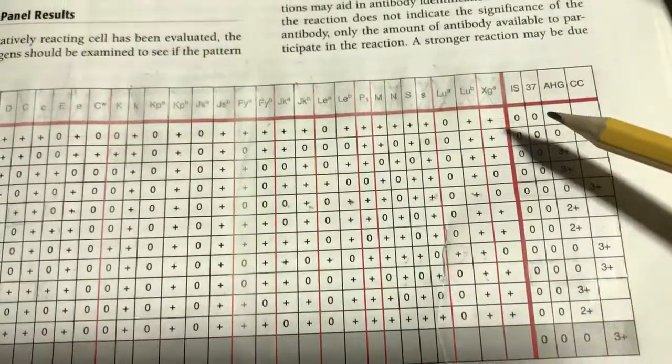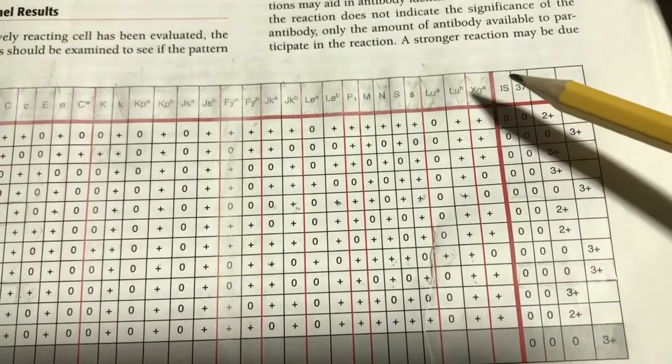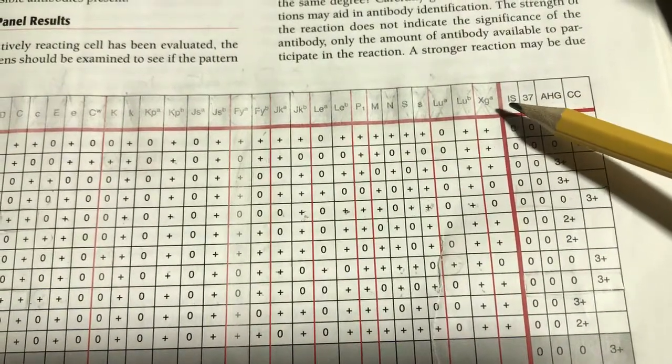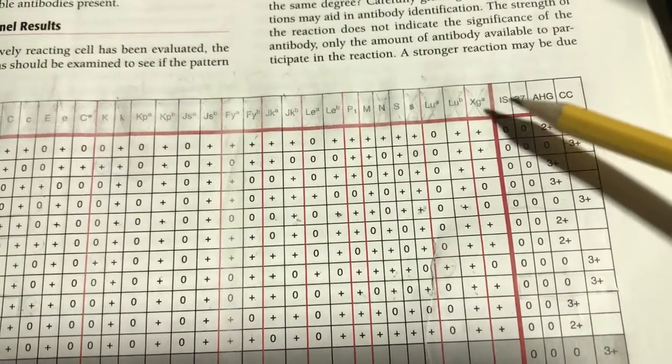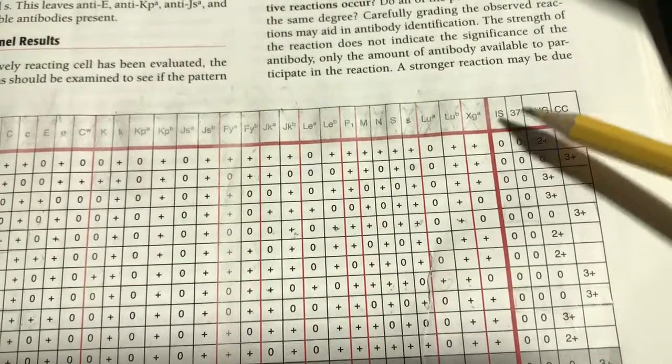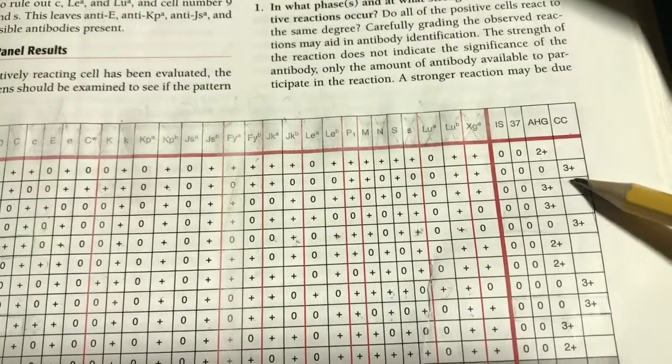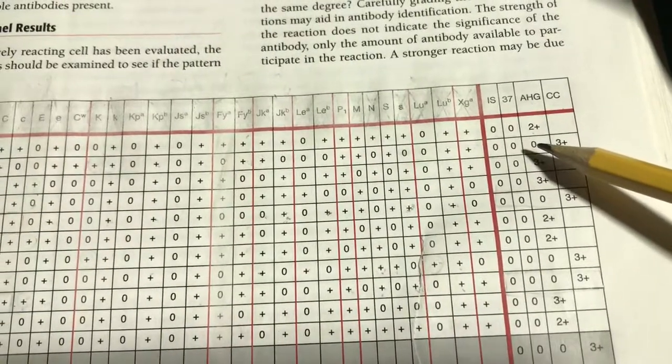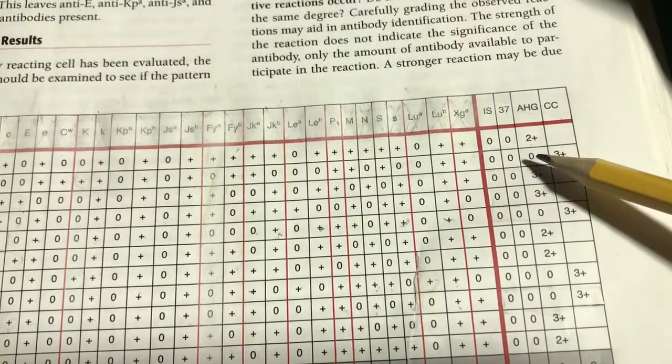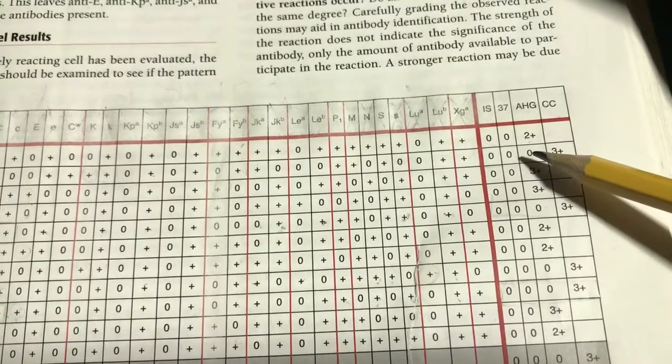These are the antigens that may or may not be present on the donor reagent cells. This is letting us know if the antigen is present or not present. We're not grading reactions here, just present or not present. Over here, we are grading the reactions.